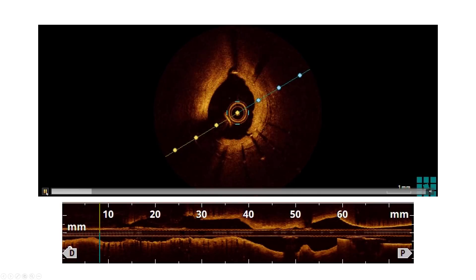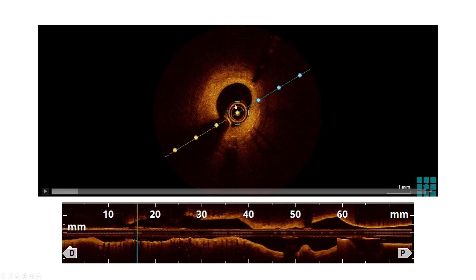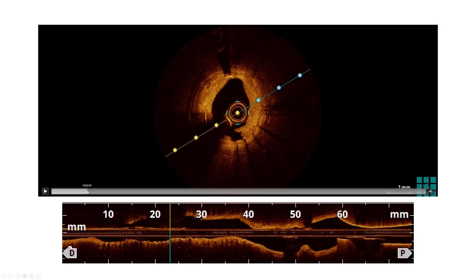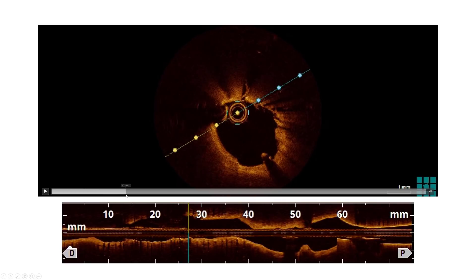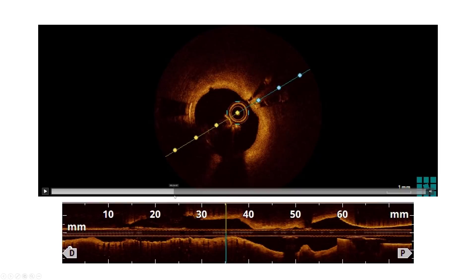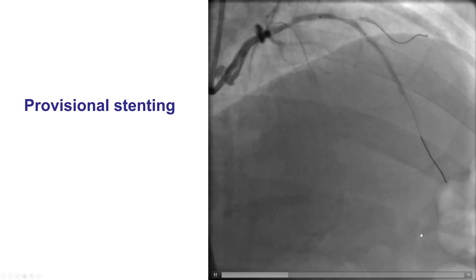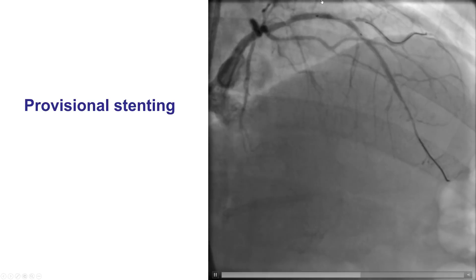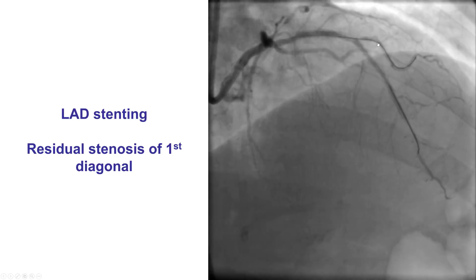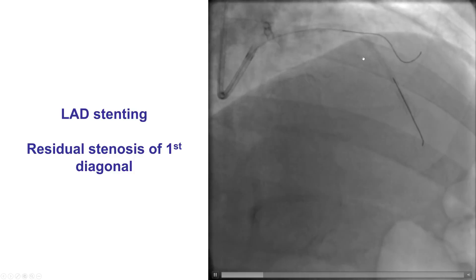We could not wire the diagonal branch originally — that's why balloon angioplasty was done first. OCT demonstrates the presence of neo-intima in the more distal stent. There is some dissection after balloon angioplasty. Coming more proximal, this is the takeoff of the diagonal branch that now has a wire in it. Even more proximal, the previously placed stent appears well-expanded without significant neo-intima. We then placed a wire in the diagonal and stented across the origin of the diagonal, achieving a nice result in the main vessel with flow preserved in the diagonal.